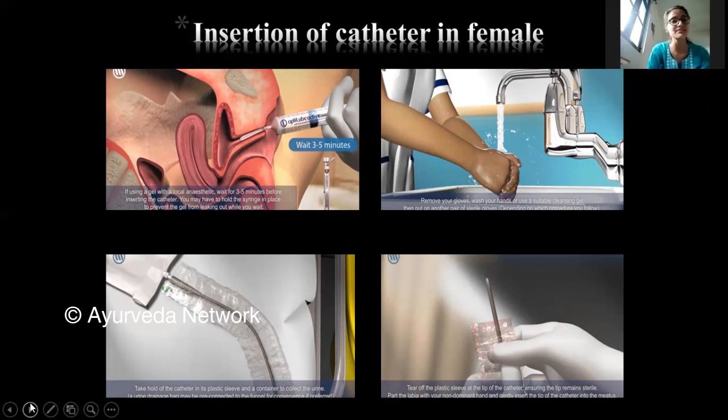Now, how should you start the procedure? Again, you have to tear off the covering from the tip of the catheter in such a fashion that you don't touch the tip of the catheter. Even with sterile gloves, you must not touch the catheter, because that is something you are going to insert inside the patient. So you should ensure that you tear off the covering without touching the tip.